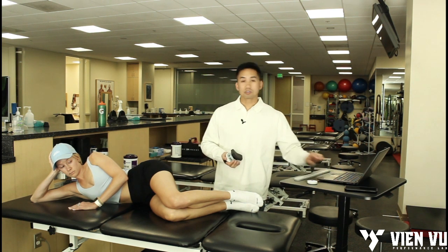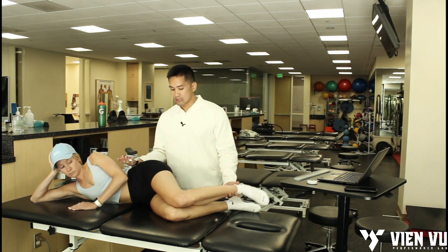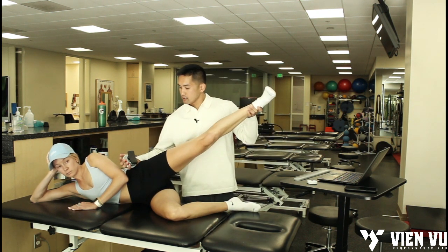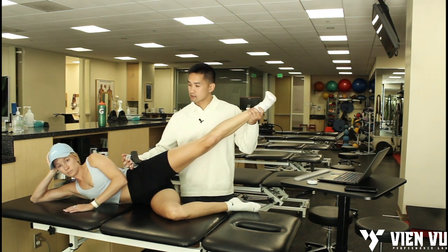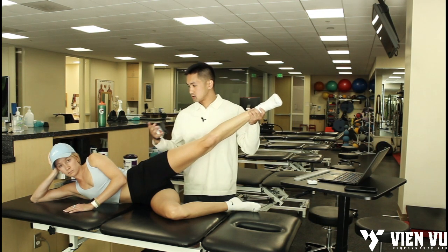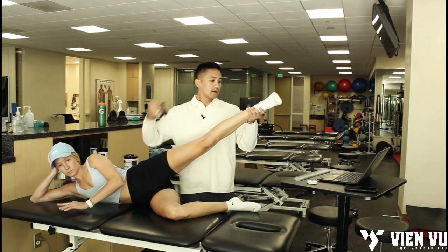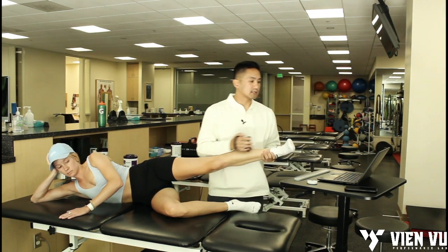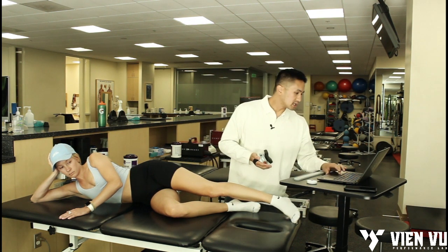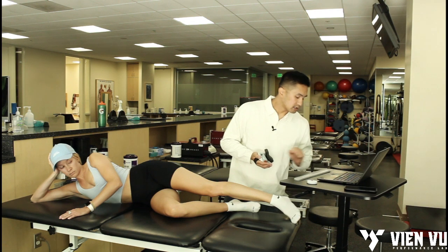The first thing we're going to look at is abduction — left side, uninvolved. Stacy, when I say go, you're going to hold and try to fight my force as best as you can. You can hold on to the table if you want, as long as you keep it consistent between each rep and each test. Ready and go — hold it, hold it, hold it, and rest. That's 36.7 — I'll enter that in my sheet.